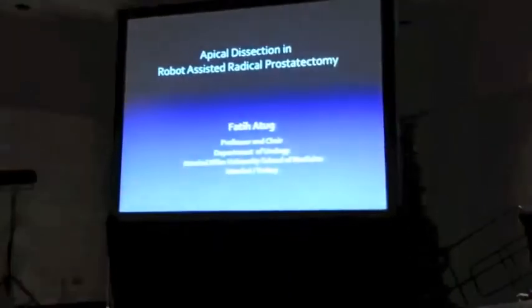Second part of the dissection, as was mentioned: there are very different prostate shapes. It may differ from one individual to another. It may be circumferential, like this, a round prostate. It may be symmetrical bilateral, or asymmetrical. It may have a posterior lobe or an anterior lobe, or can be blunt at the end above the sphincter. So we have to look at these results. There is no overlap in only 15% of cases. There is significant overlap of prostate tissue over the sphincter in 85% of cases.